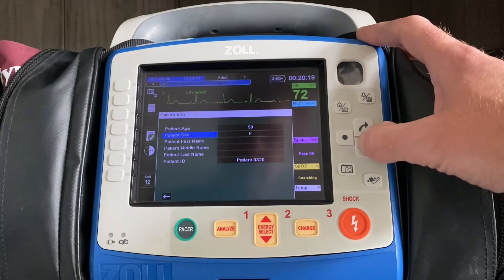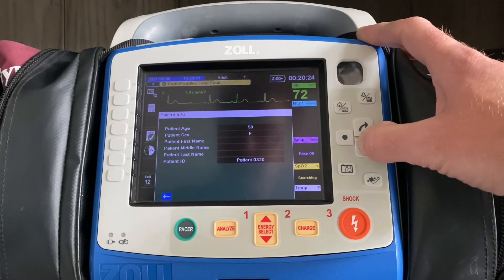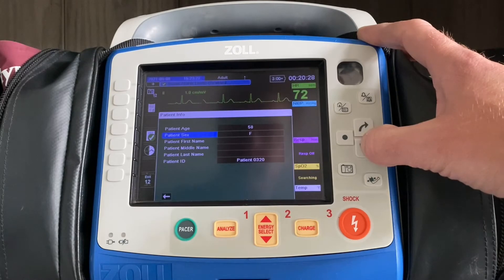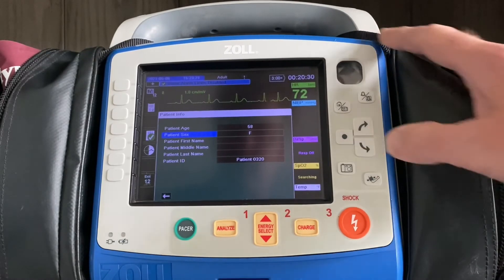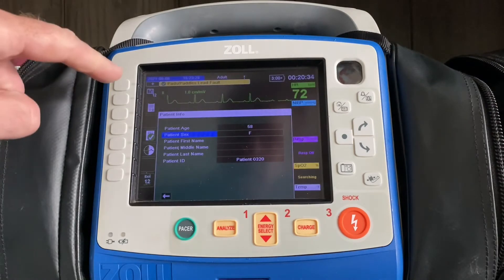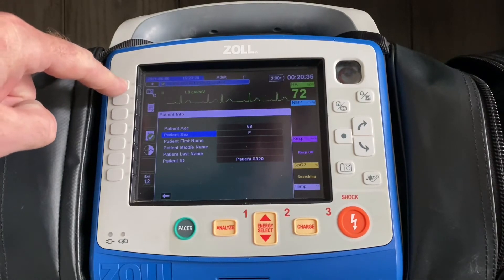Where we see a lot of people press too many buttons is they go all the way down to the bottom arrow — you don't need to do that. As soon as you're locked in with age and gender, again, you're going to take a picture of the patient's heart, so the camera with the 12 will start the acquisition process.